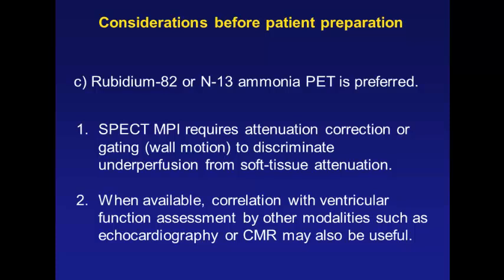Now, there is the problem that if you're not using attenuation correction, you not just mix two technologies with different spatial resolutions, you also mix corrected images with uncorrected, and you might then have an attenuation artifact, which is then, of course, taking up FDG, and you think, oh, this is hibernating myocardium. Again, if there is an attenuation artifact, maybe it's not contracting there either, because the contour detection is difficult. Watch out for this and use attenuation correction if you take SPECT.